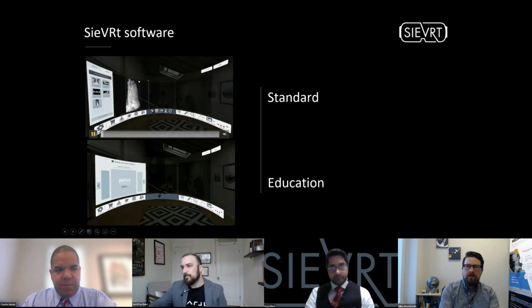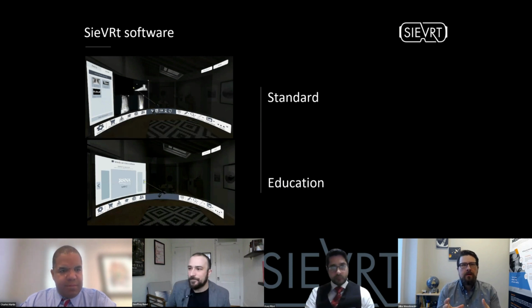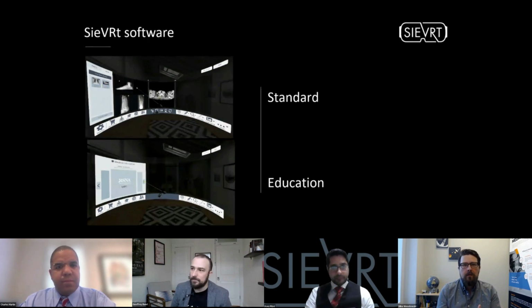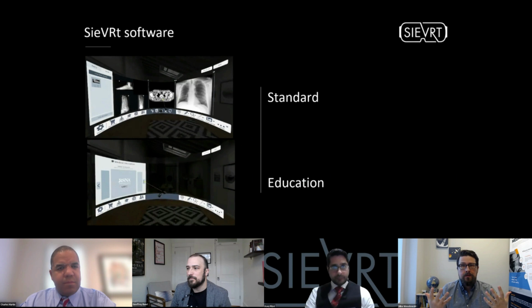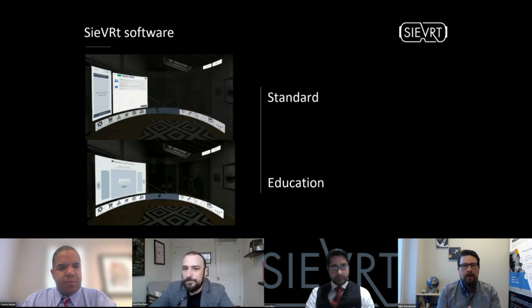Yeah, maybe I can start off, and then I'll hand it off to Aves as well. So as I mentioned earlier, we've done a lot of work to try and mimic the physical space of a reading room in virtual reality. So in this video, you can see we have three large screens that can visualize effectively DICOM medical images. Whether those are CTs or X-rays or ultrasounds, we can read all of those images effectively.